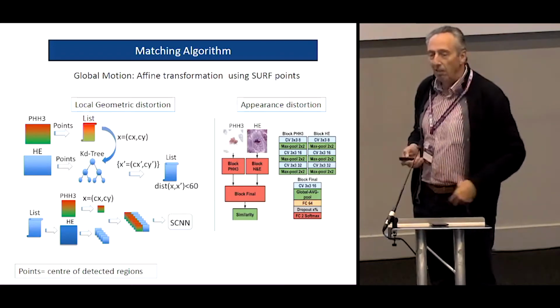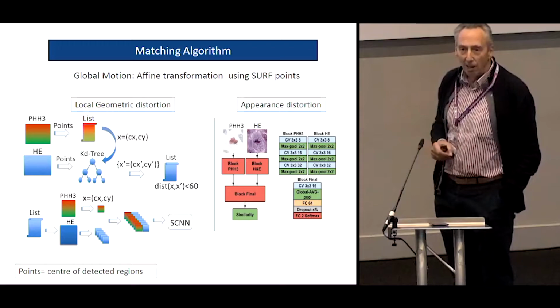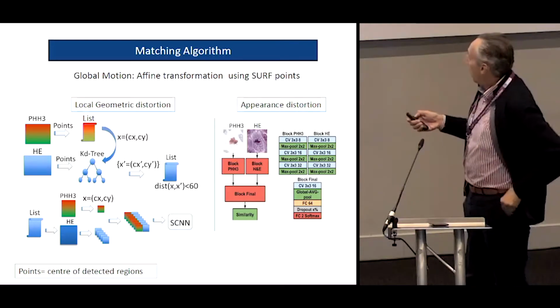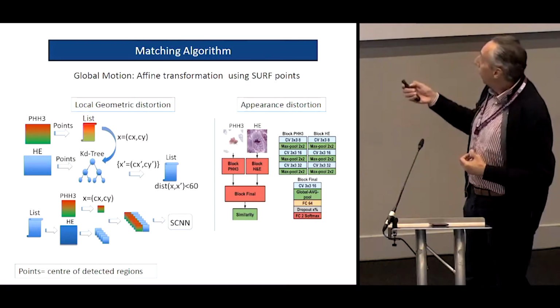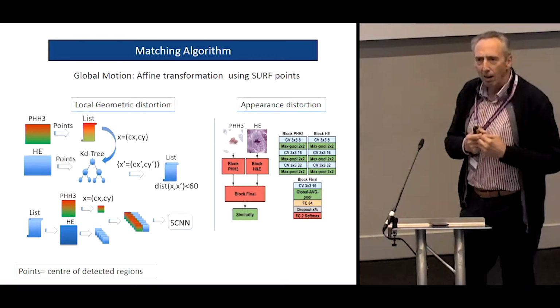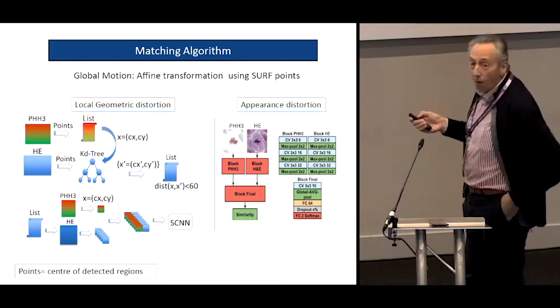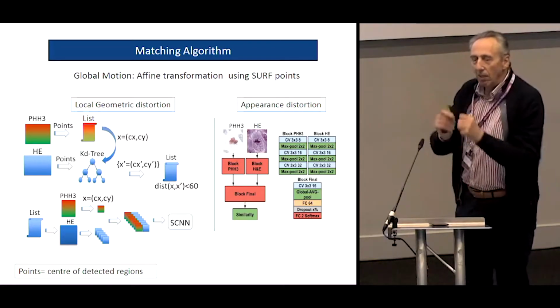In order to assess which is the good one, we use a CNN model. In our case, it is a Siamese network. That implies we extract features from one of the images here and the same here. Both are the same model; they share weights. Here we make a fusion of features, and here we compute some similarity distance. What we are minimizing is: when you put in images from the same category, the good ones, the similarity distance has to be small, and when we put in images which are not the same category, the similarity distance has to be large. That's the way we train this. So at the end, you have one threshold, and you decide which is the best one. In our case, we always decide on the one with the smaller distance.